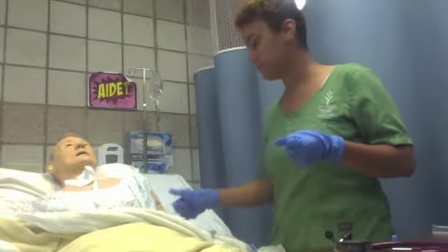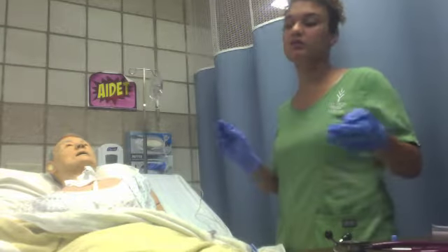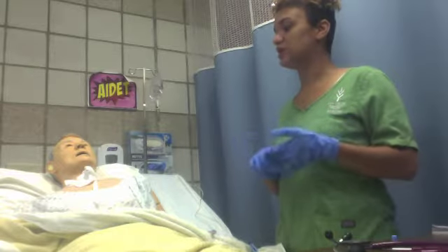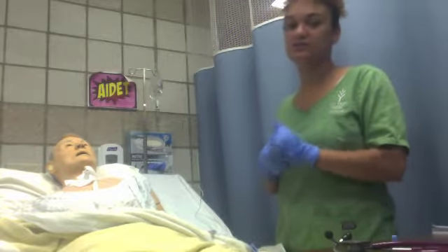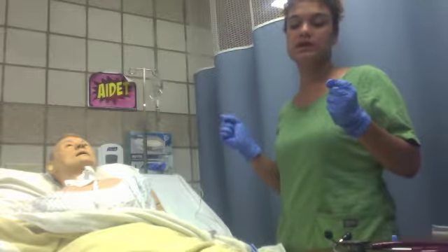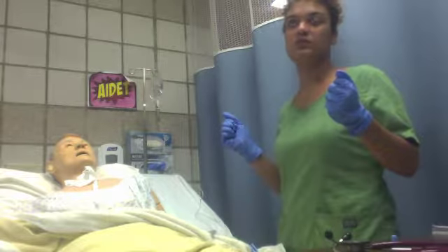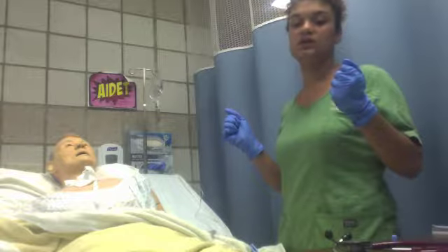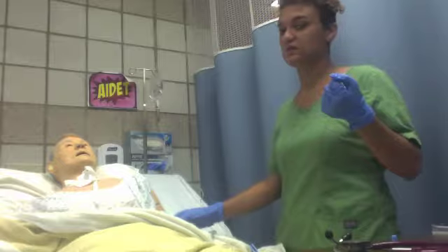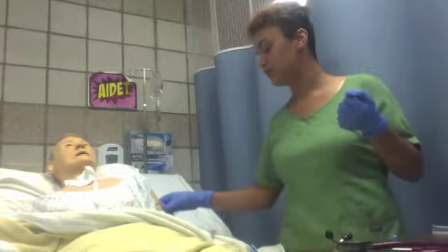And that is within the time frame. I'm also looking for coolness, pallor, leakage, warmth, redness, pus, any signs of infection at all, any signs of phlebitis. I'm looking for any blood or any moisture within the dressing, or if the dressing is peeling off, I'm going to be checking for that, making sure that the dressing is patent.